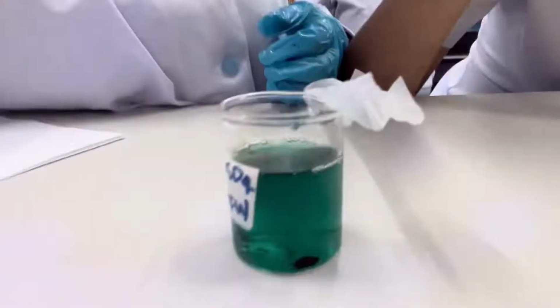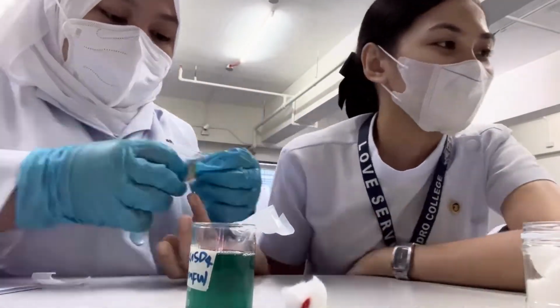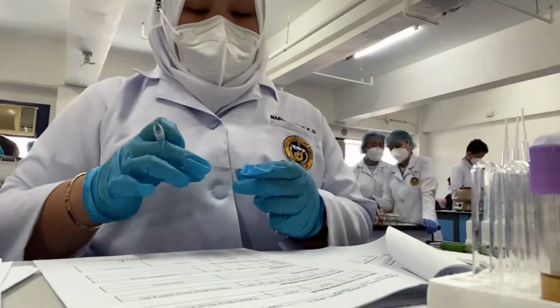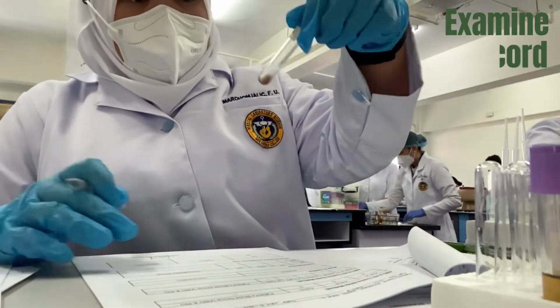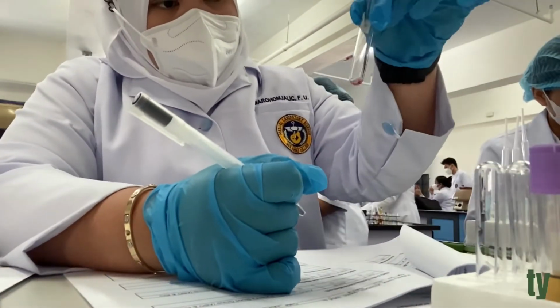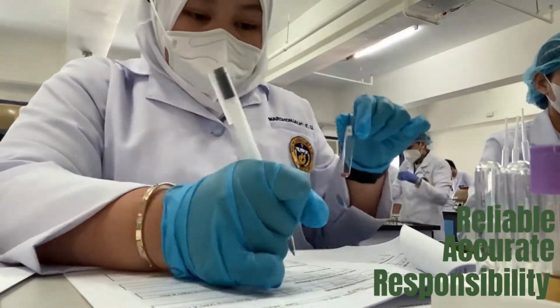Check whether the blood sinks or floats. After the test, apply patient care by putting on Band-Aid. The last step in every test procedure is to examine and record the results. As a medical technologist, it is our responsibility to release an accurate and reliable result to our patient.